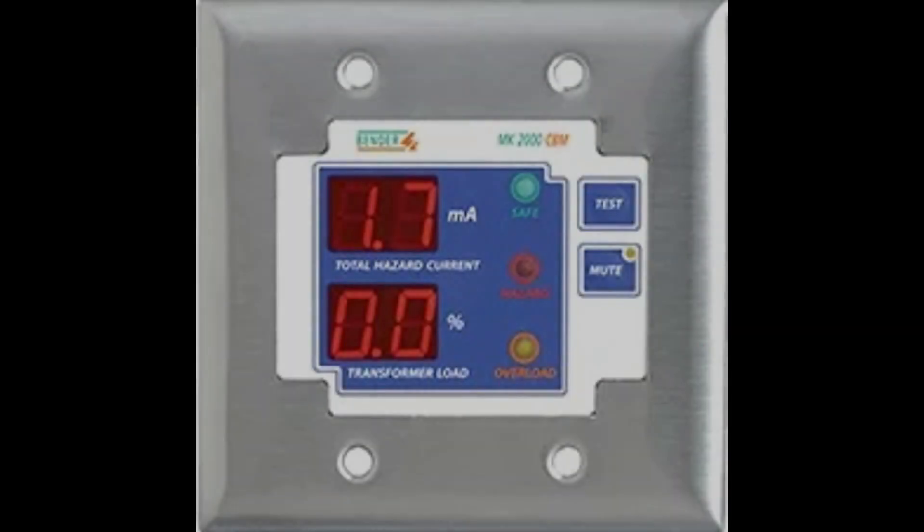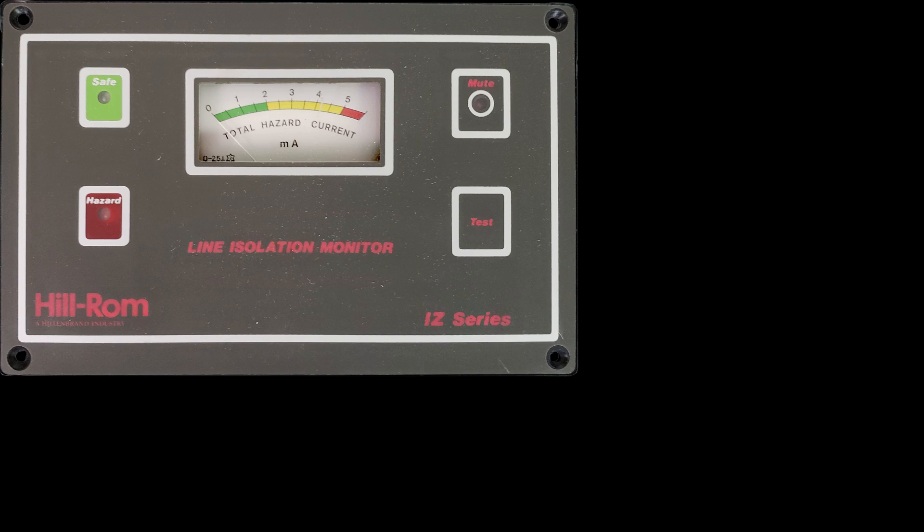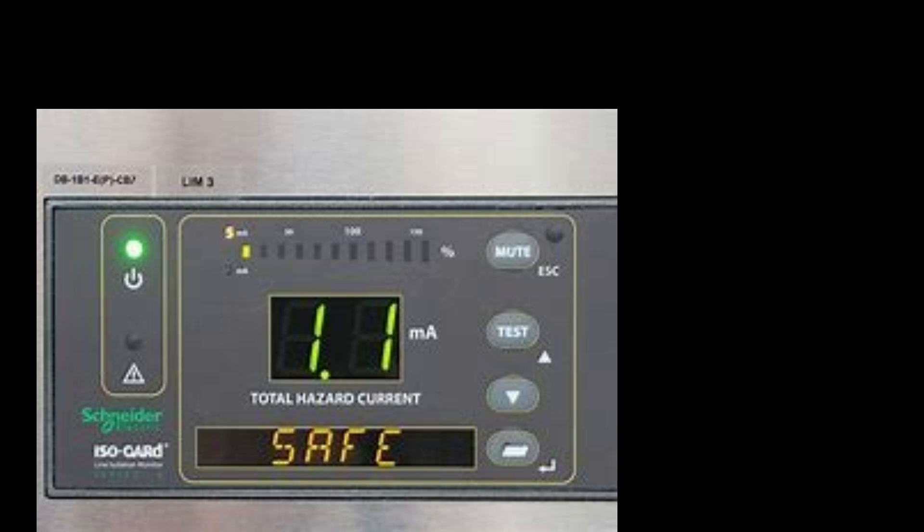There is an average of 600 surgical fires a year. The Joint Commission has updated their concerns about surgical fires. This video is to explain the NFPA codes, how to properly test the LIMs, how often they are to be tested, and how to document each test.